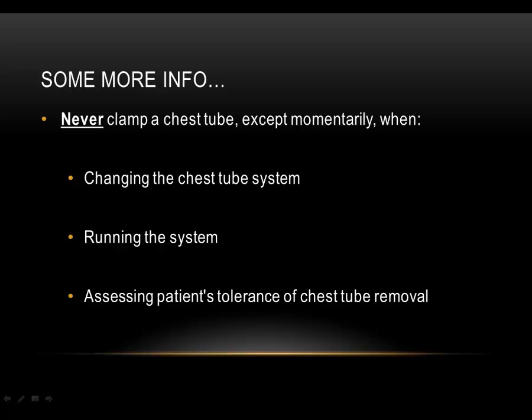One of the few indications for clamping drains is during transfer of the patient either to or from a bed, during which it may be necessary to raise the drain above the level of the patient. Raising the drain risks siphoning the drain contents back into the pleural cavity. During transfer, one person should take responsibility for the drain, and ideally, the drain should be pinched temporarily, not clamped. No clamped drain should be left unsupervised, and a drain should not be clamped during transport.